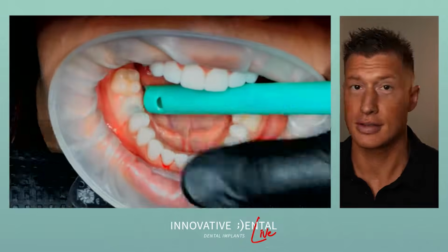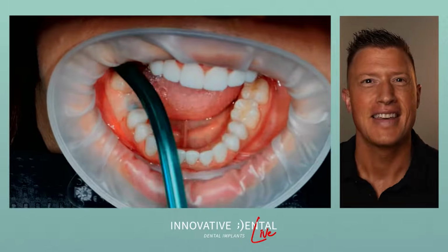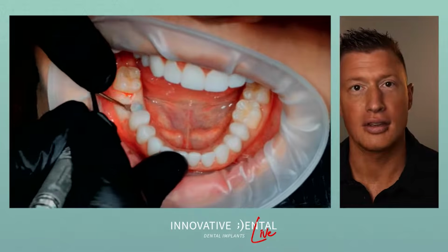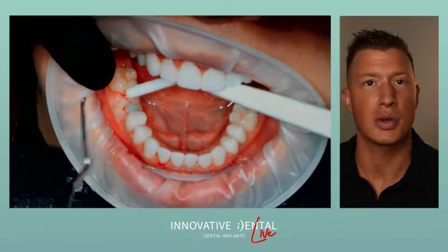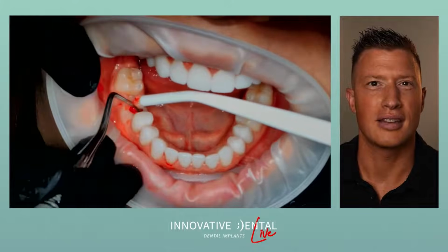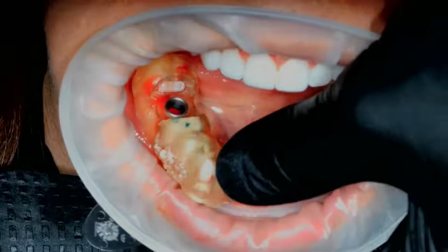All right, so here you'll notice that I'm doing a tissue punch on the gums using a little device that's really called a tissue punch. And now I'm going to remove that piece of gum tissue. The reason I can do that is we have great gum tissue. Because we grafted and kept that nice bulky ridge, that tissue remained nice and healthy. This implant we're going to use is called a Ditron Ultimate implant. I really like it. It's got a lot of great properties.